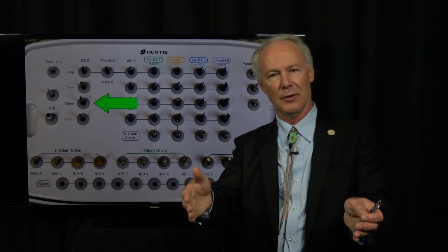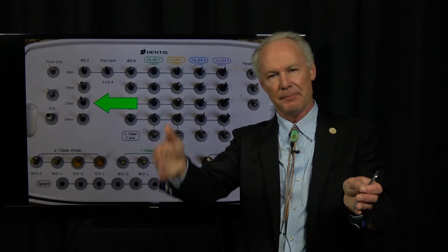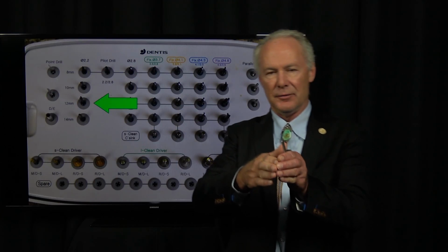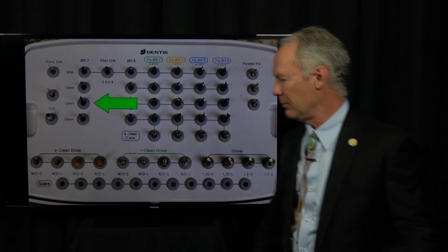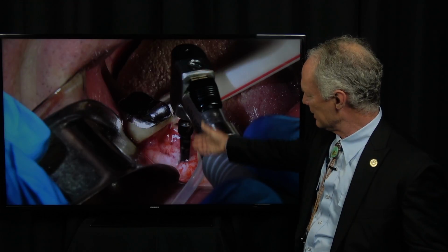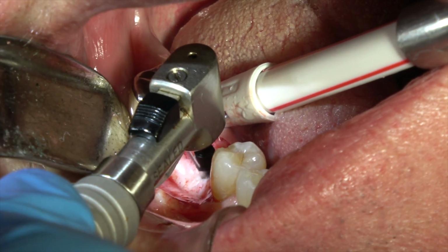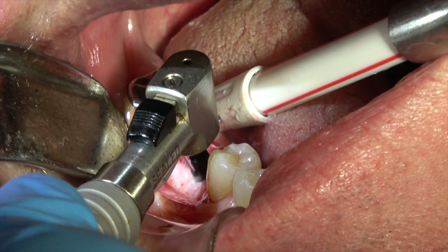You don't want to drill the hole all the way out to the extent of the facial and the lingual dimension of the alveolar crest. You want at least 1 millimeter on the facial and the lingual if possible. If you go past it, you may have to bone graft. And you want to align this with the teeth on either side, both lingual facially and mesial distally.